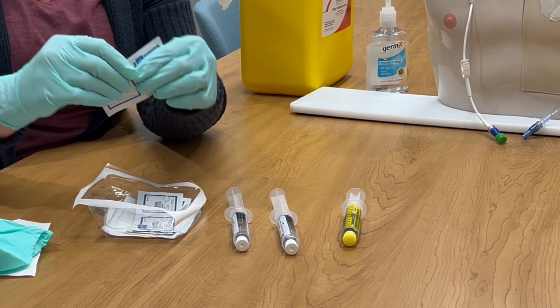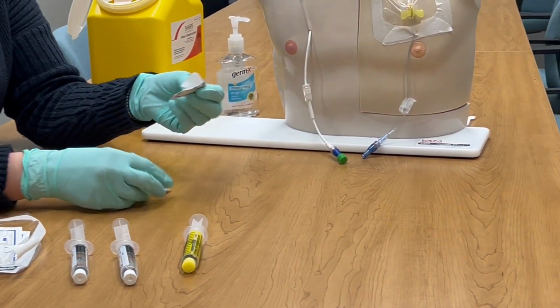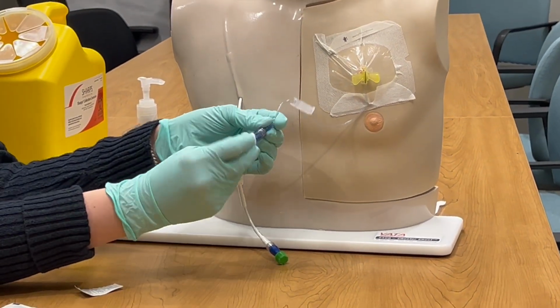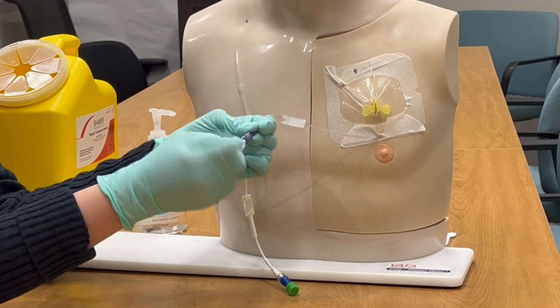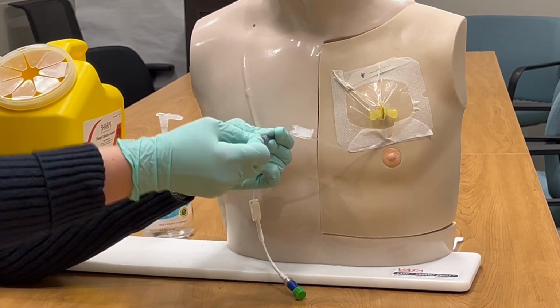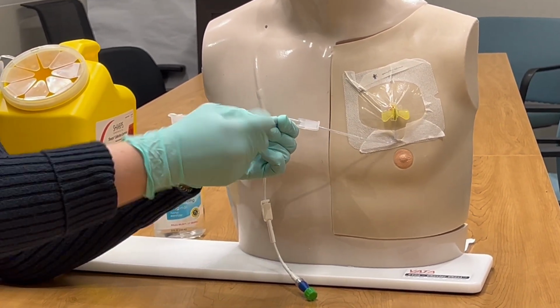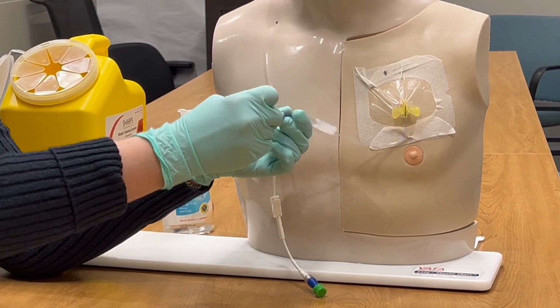Next, we're going to take an alcohol pad out of the kit, rip it open, and we're going to clean the end of the needle for 15 seconds. You want to just twist it and rub it around on the end, on the flat part and on the sides. Make sure it's really clean.